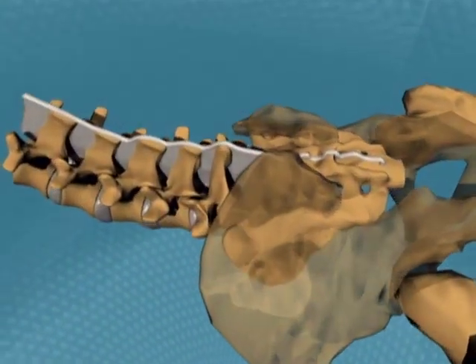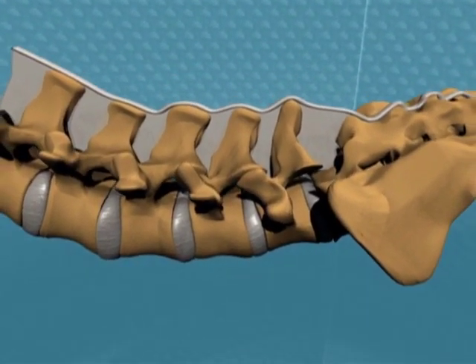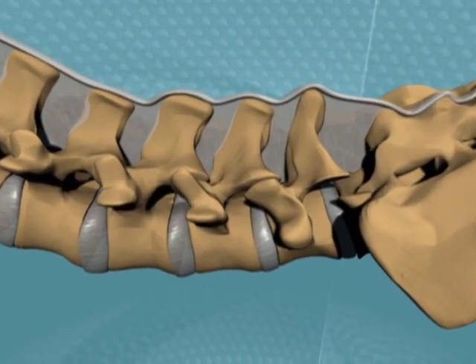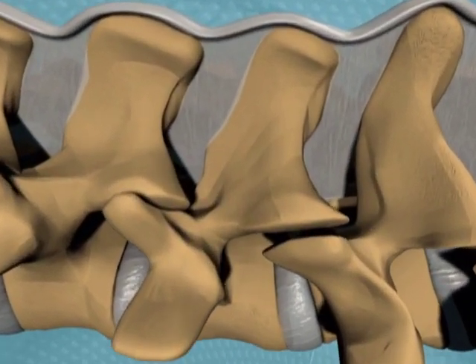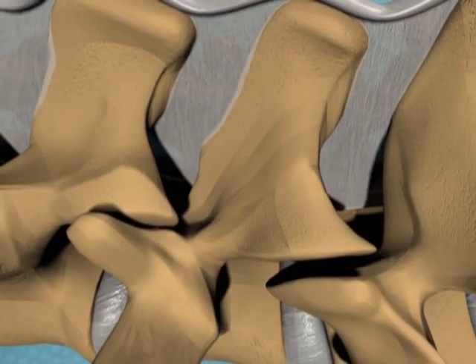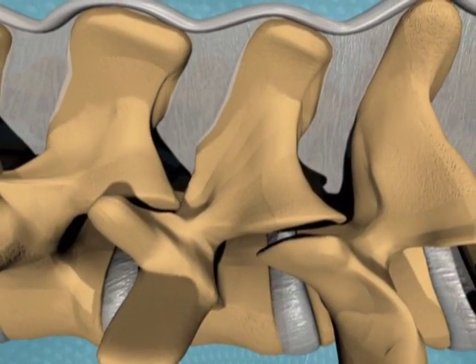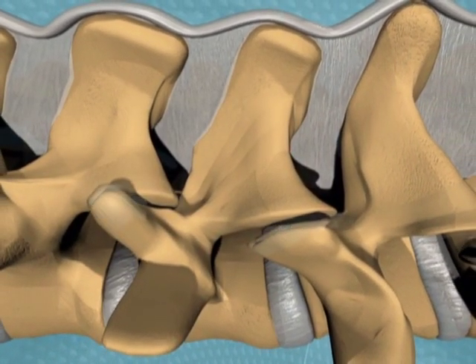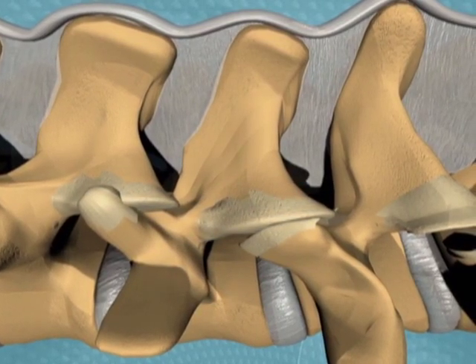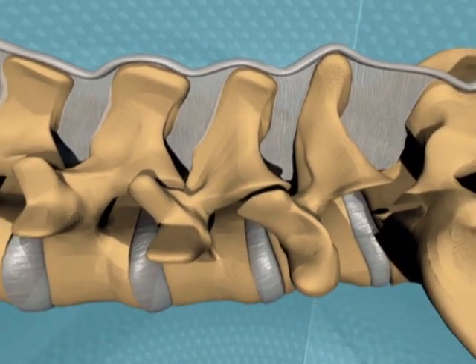Depending on surgeon preference, the supraspinous ligament may be left intact, reflected, or removed entirely. If a decompression procedure is desired, care must be taken not to remove excessive amounts of bone. Aggressive bone removal may also increase the chance of fracture of the adjoining spinous processes and posterior arch. If the facets are hypertrophied and do not allow for proper anterior placement of the implant, the facets must be trimmed.